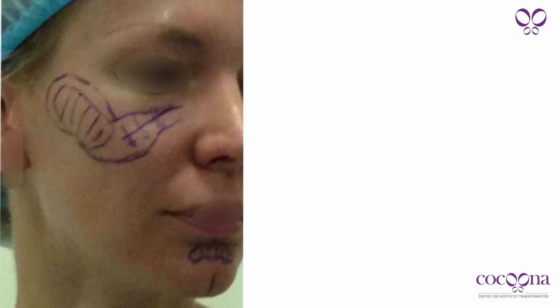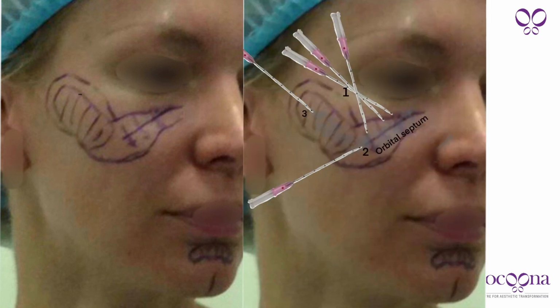In this patient you will see the tear trough deformity is associated with a tight retaining ligament that causes a band. A simple injection of filler does not solve the problem. So filler can be used to improve this condition, but the technique involves using a cannula in a surgical way to go perpendicular and break the retaining ligament and simultaneously inject the filler.